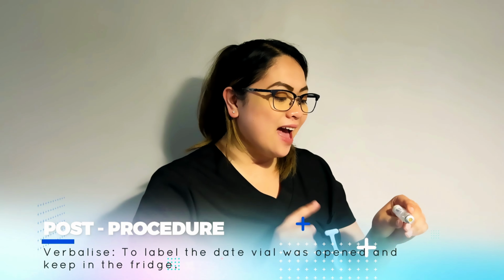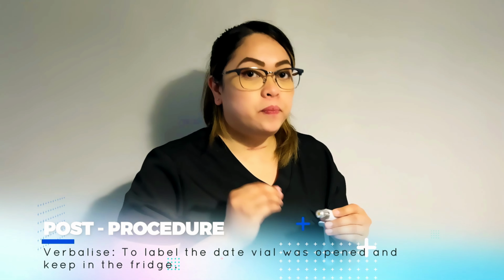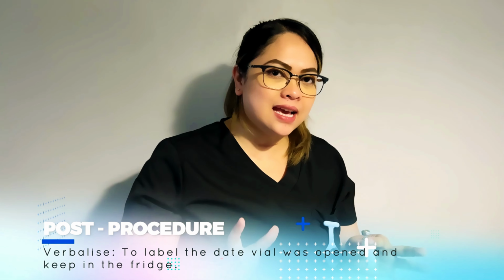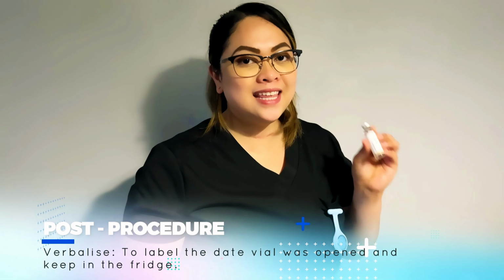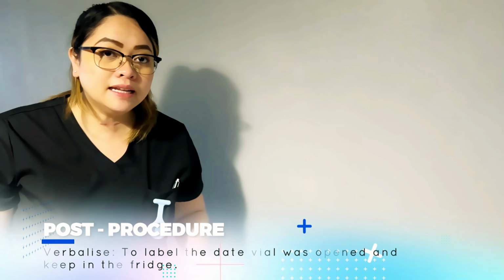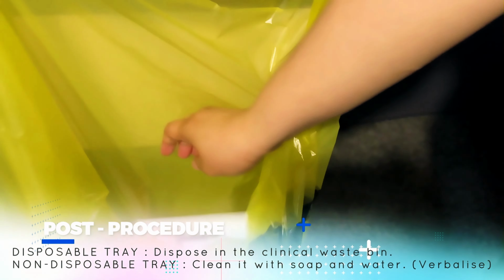As you can see, I have labeled the vial from when I opened it, okay? But I think in the exam, you can just verbalize it, okay? And then verbalize that you're going to put this vial back in the fridge. Since this tray is disposable, I'm going to dispose of it in the clinical waste bin.